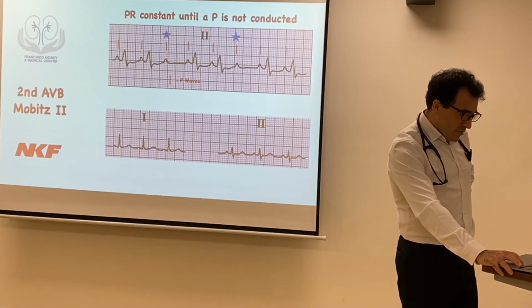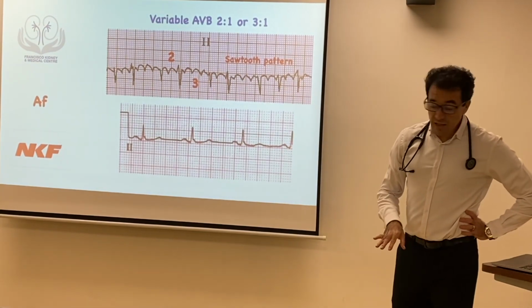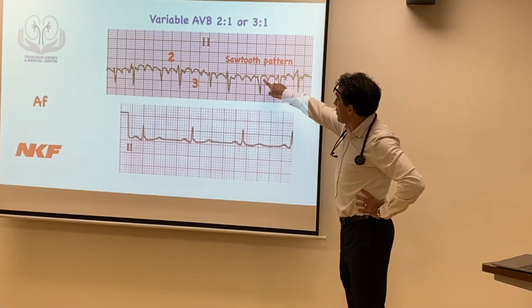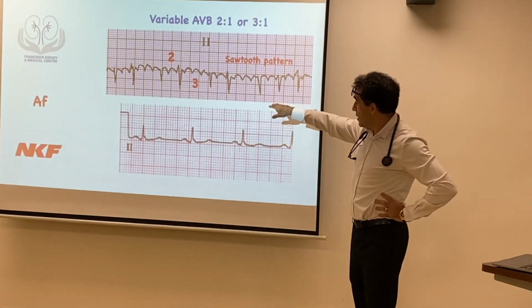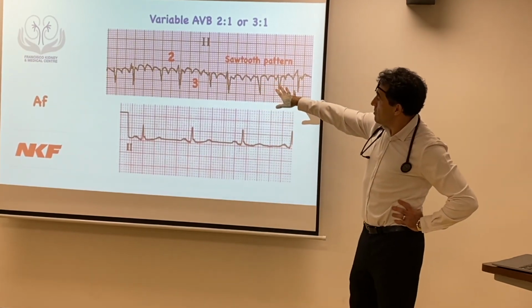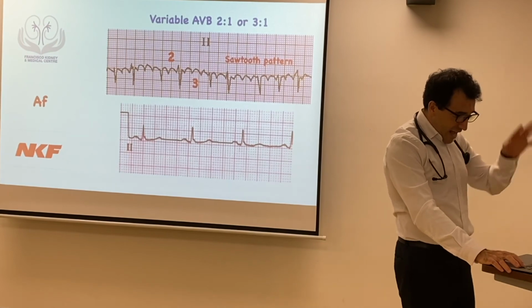Okay, for example, this one is atrial flutter. These are the atrial flutter contractions, which you can call P waves, but they are the atrial contraction of the flutter, and this is different from the other one, the AF, atrial fibrillation.